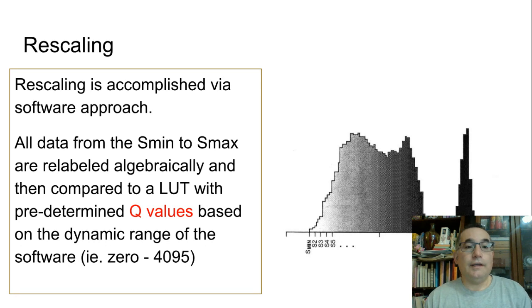So in this rescaling, all of the data that is now from S-min to S-max. Remember, those S-min and S-max boundaries were determined earlier by pattern recognition and some of the other things we've discussed.